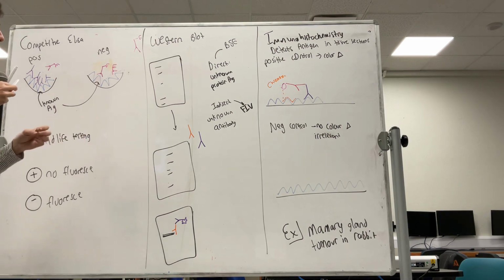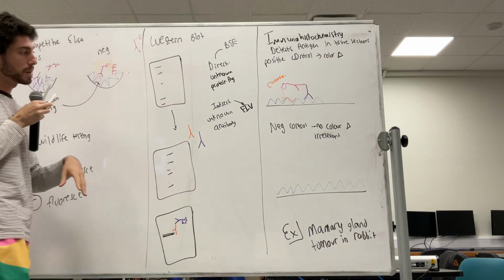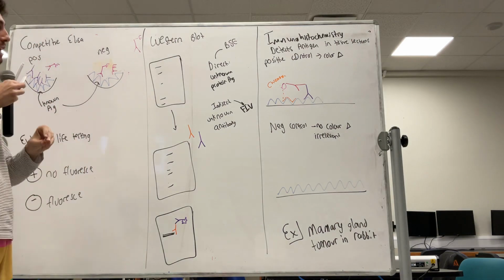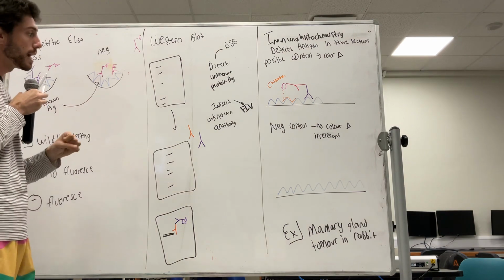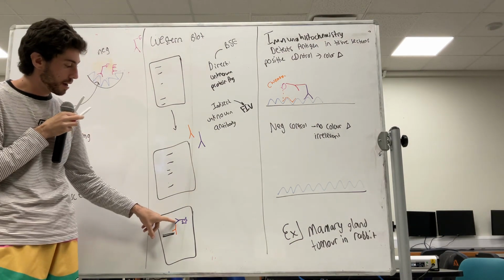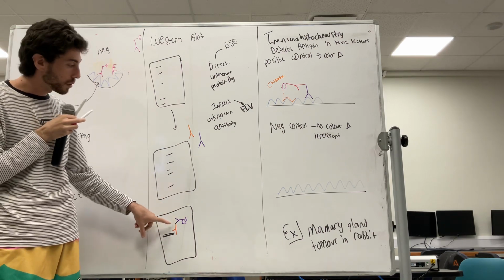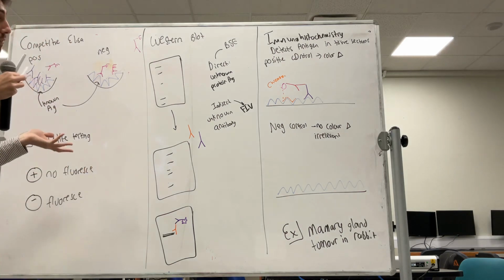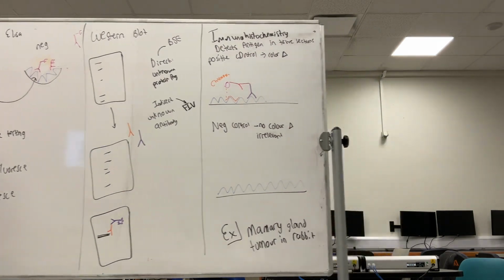And the indirect is going to be an unknown antibody, so it'll be a known antigen. If we know what the antigen is, we're going to run our patient's serum over that, and if the patient has an antibody for it, it's going to stick, and then we're going to run it with the fluorochrome. If our patient does have the antibody, we're going to see fluorescence. So that's kind of a cool one. It's really neat. It's charged. Okay, great. So let's go to the last one.